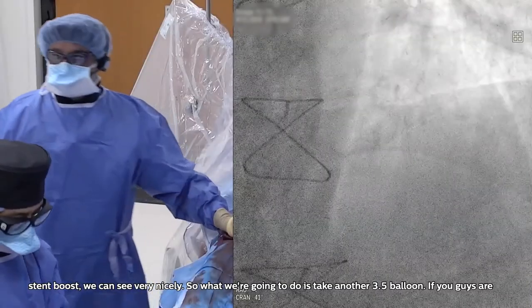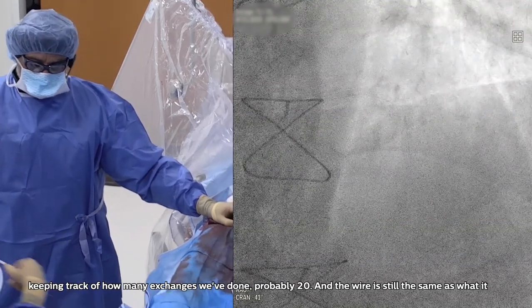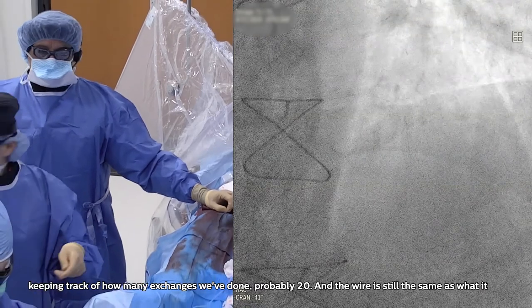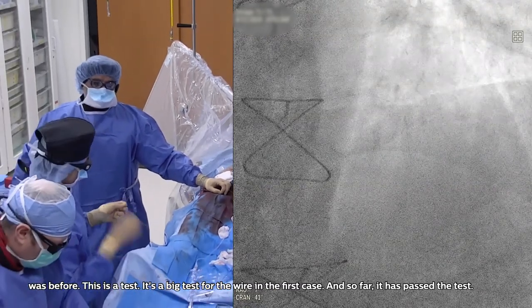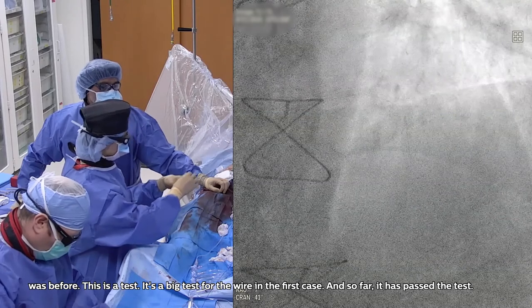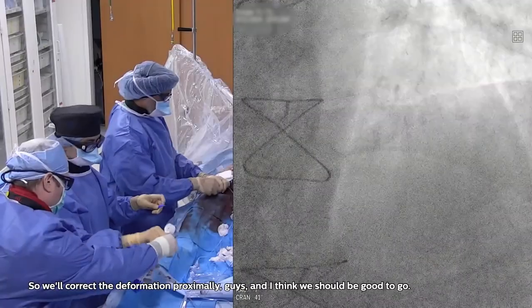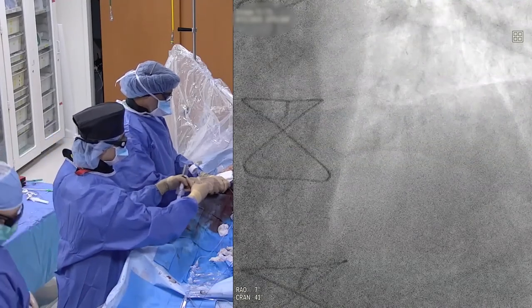So what we're going to do is take another 3.5 balloon. If you guys are keeping track of how many exchanges we've done, probably 20. And the wire is still the same as what it was before. This is a test. It's a big test for the wire in the first case. And so far it has passed the test. So we'll correct the deformation proximally, guys, and I think we should be good to go.